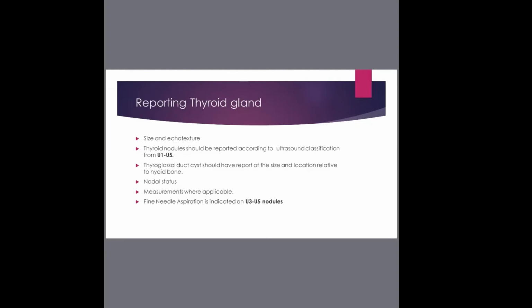I'm not saying you don't have to write the size, but it's not really important. Focus more, because sometimes that measurement makes you lose focus on the diagnosis, not just in thyroid, even in other areas. Some people, when they want to scan the liver, they just go straight to taking measurements. Meanwhile, what is more important is to sweep through, looking for things that are not there. That's what we are as sonographers, we look for things. If we don't see them, we know that we didn't, but not to focus on a particular thing and then lose out on those subtle things.